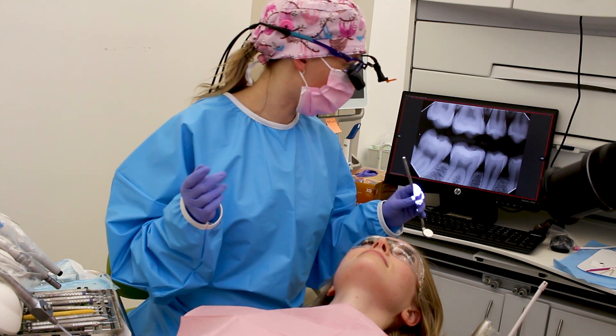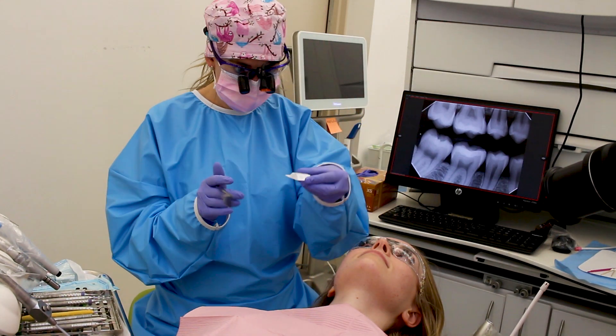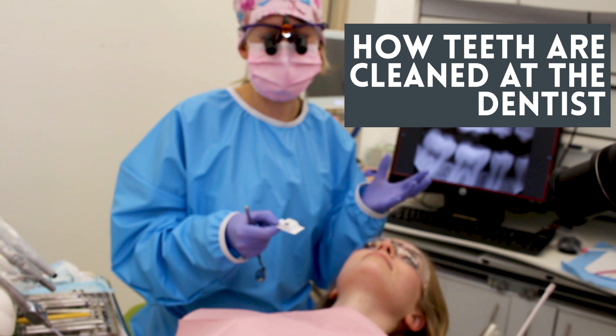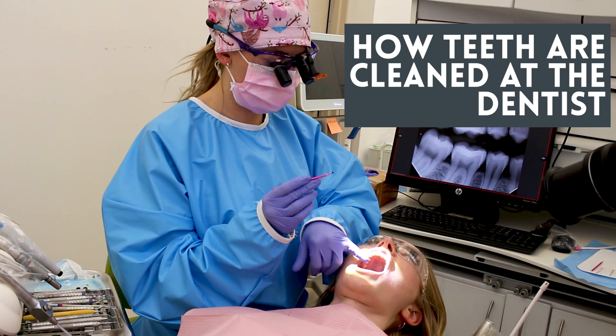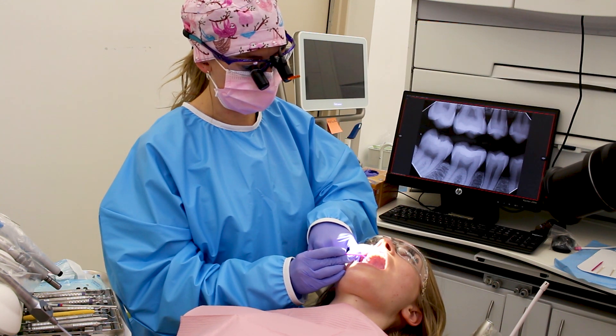The first thing I'm going to grab is this — it's called a disclosing solution or agent. It's a purple dye that will stick to any spots where we have plaque on our teeth. We've got a little micro brush and what we're going to do is paint it onto the surfaces of the teeth.